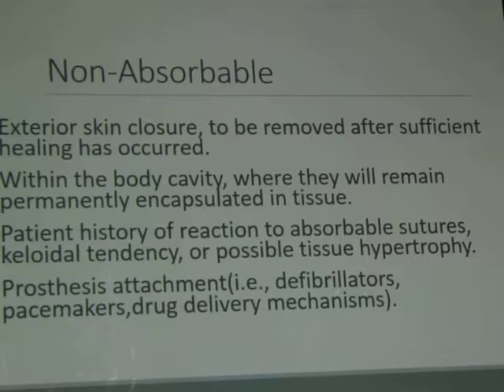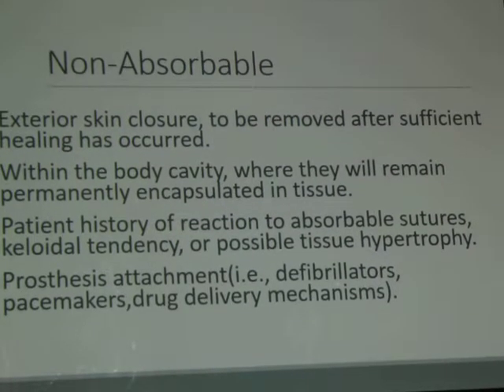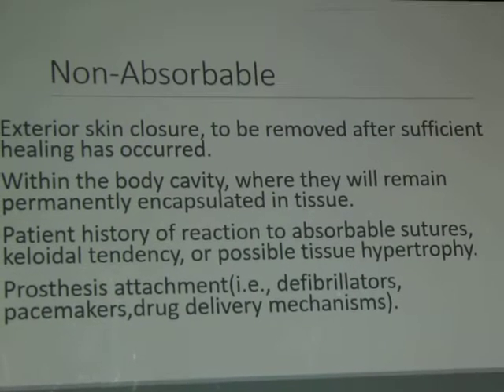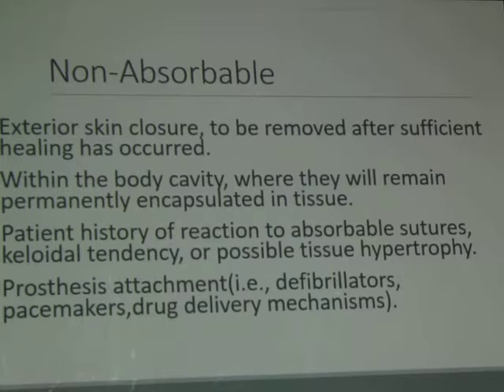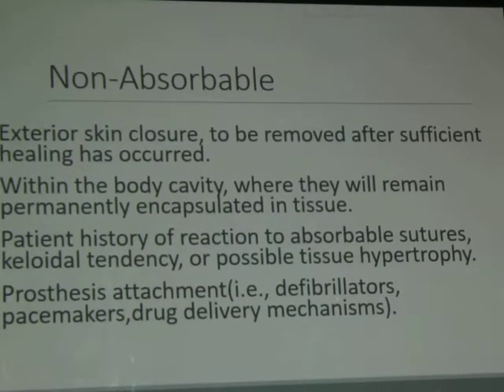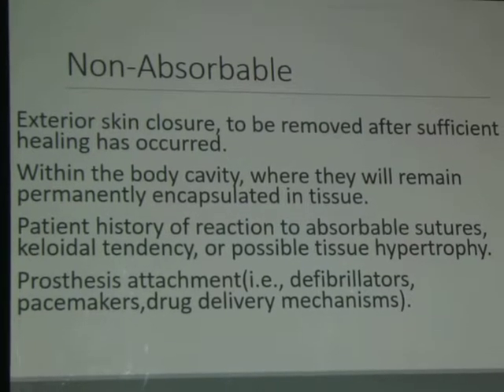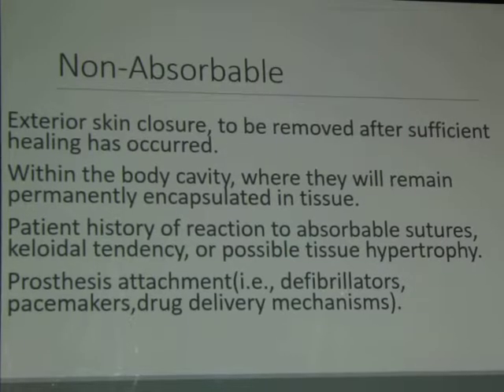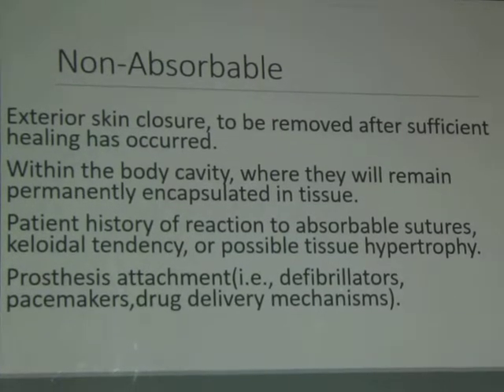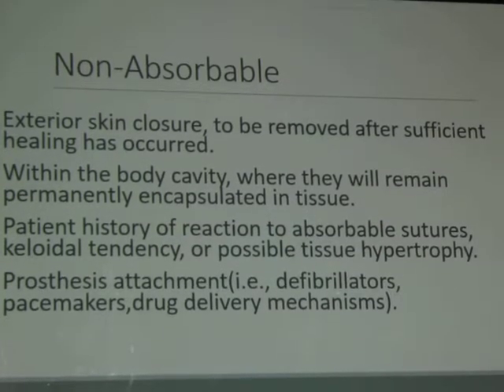Extremely painful. And I cannot afford the sternum to move and be open to the outside. One of our professors did open heart surgery in America and his sternum did not heal. He got osteomyelitis in the sternum and had about 99 operations until it healed. So non-absorbable sutures should be used where I want to be absolutely sure that nothing will move, nothing will give way.